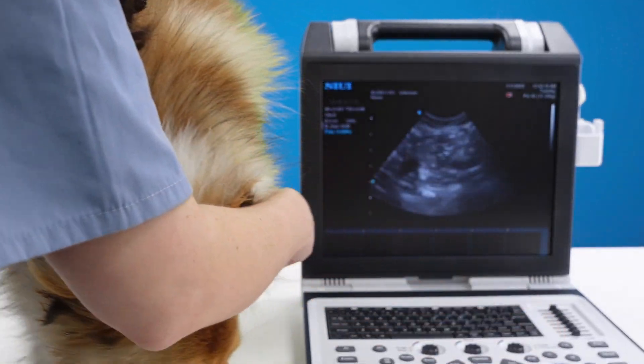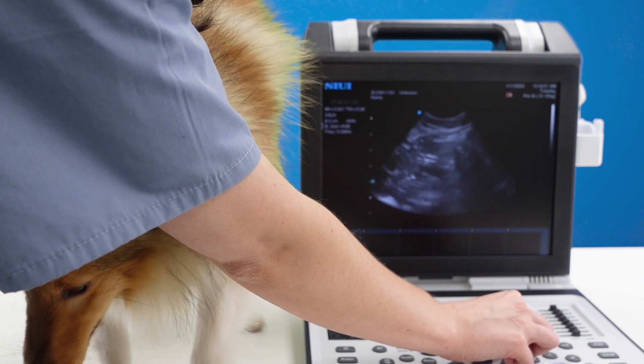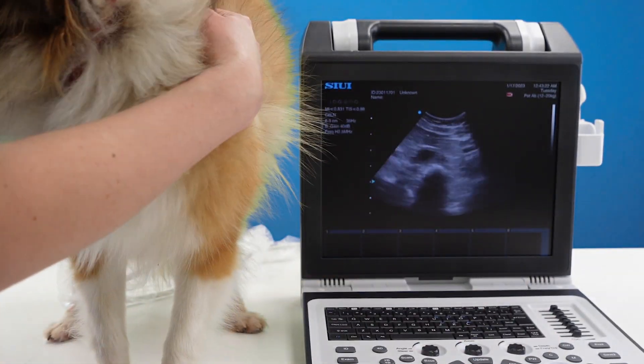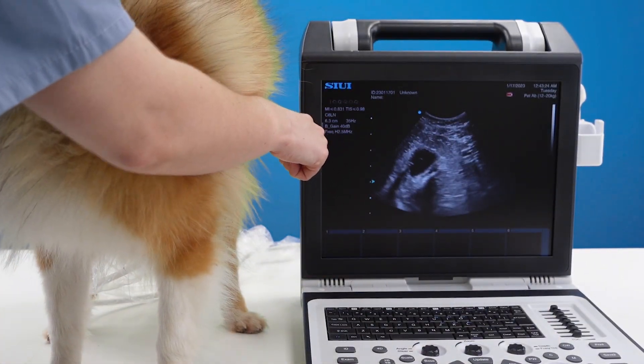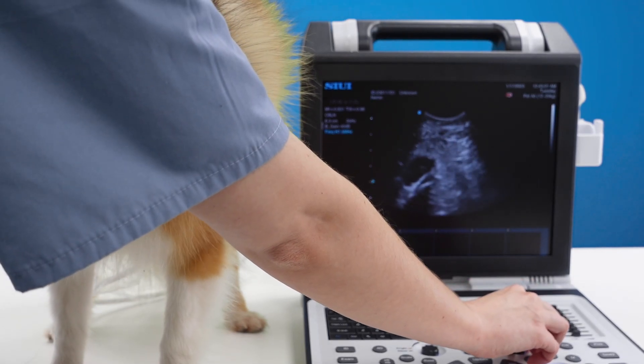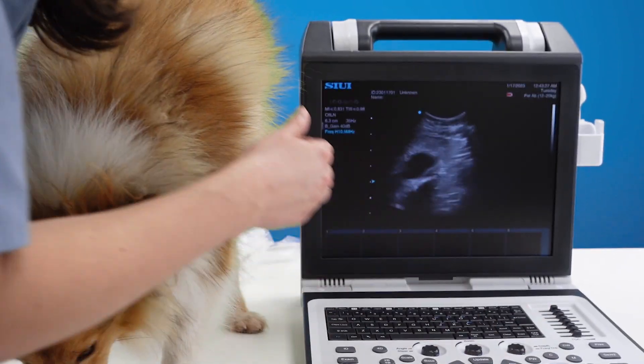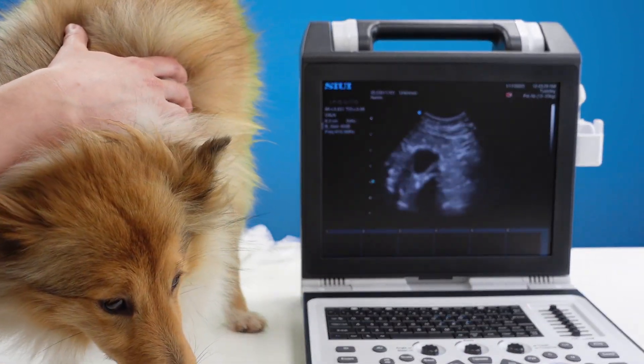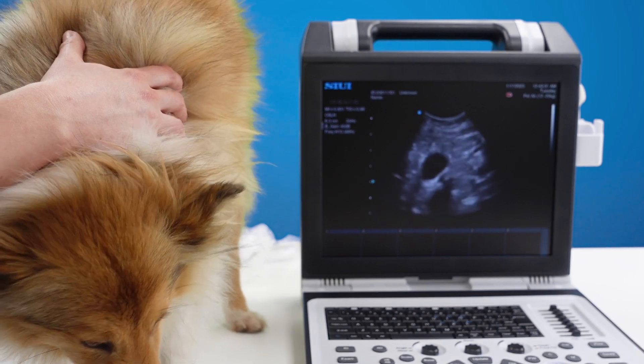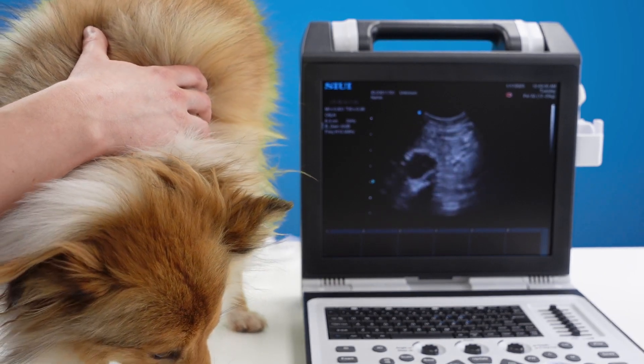Once you go past the highest of the fundamental frequencies harmonics will just automatically toggle on which is the H in front. In this particular instance tissue harmonic imaging is helping my image.